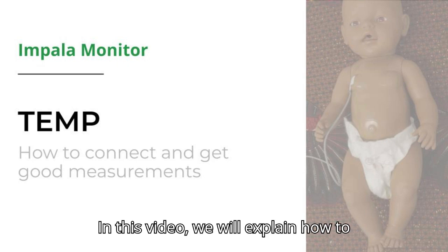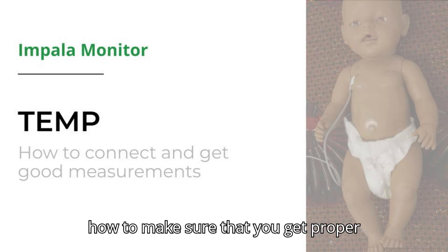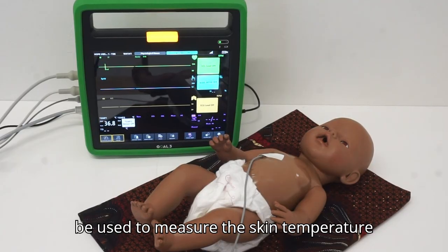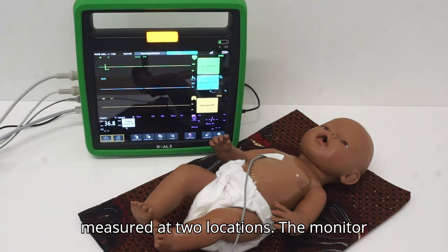In this video, we will explain how to use the temperature probes, what it measures, how you should connect it, and how to make sure that you get proper measurements. The temperature probes can be used to measure the skin temperature of the patient continuously. There are two probes so that the temperature can be measured at two locations.